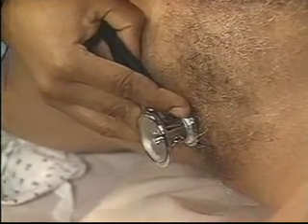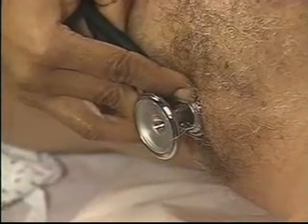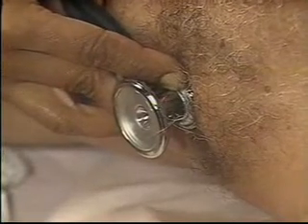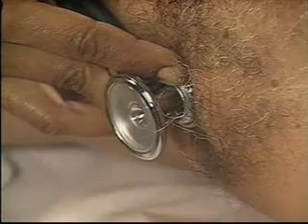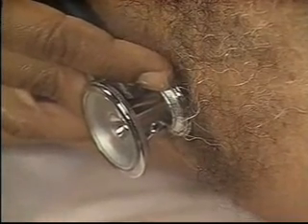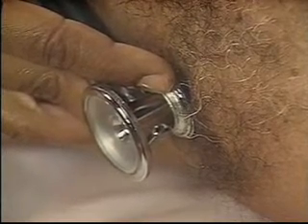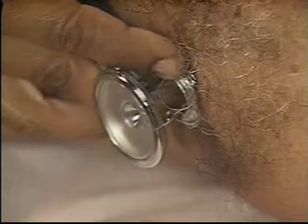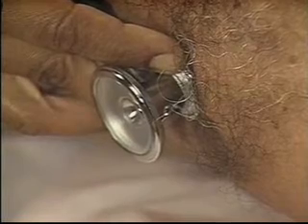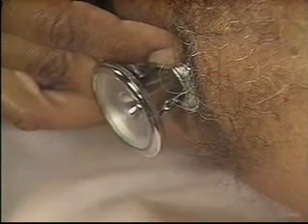Now, notice how the third heart sound disappears when the bell is placed more firmly on the chest wall. Listen again with light pressure. With firm pressure. And once again with light pressure.